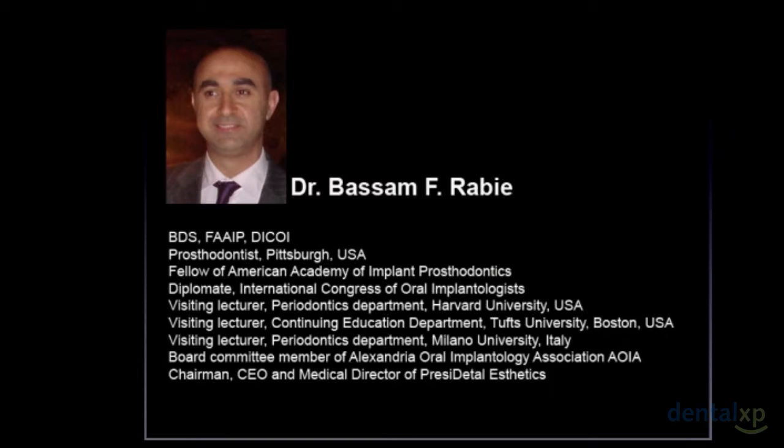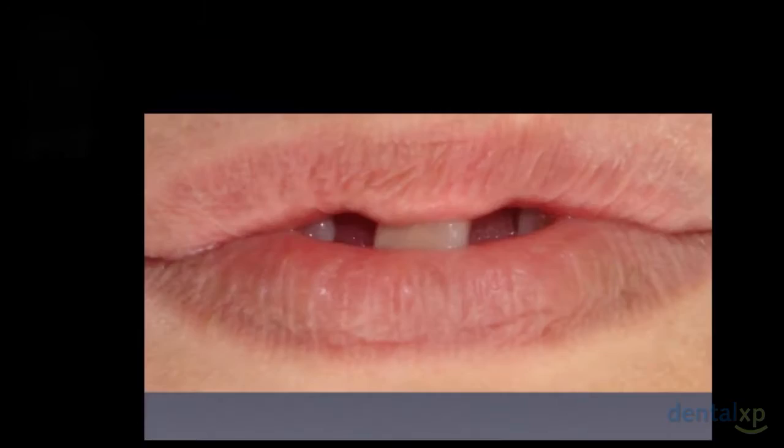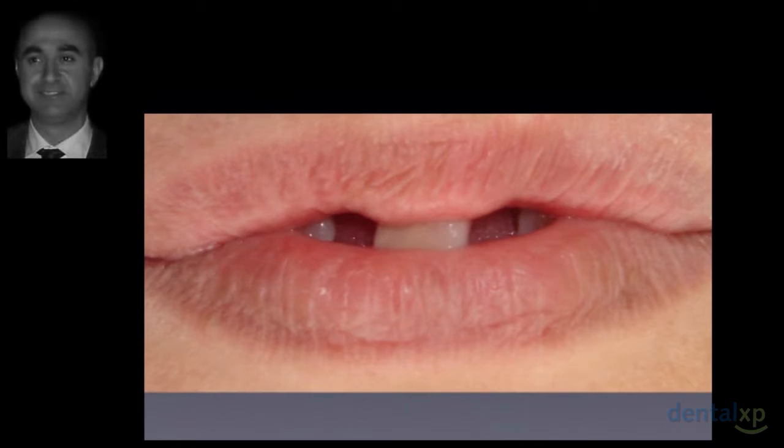This video is actually a continuation of the last case I showed on Dental XP, showing the surgical and prosthetic reconstruction of a compromised case of the anterior maxilla. Just to refresh the case itself, this is how the patient presented.